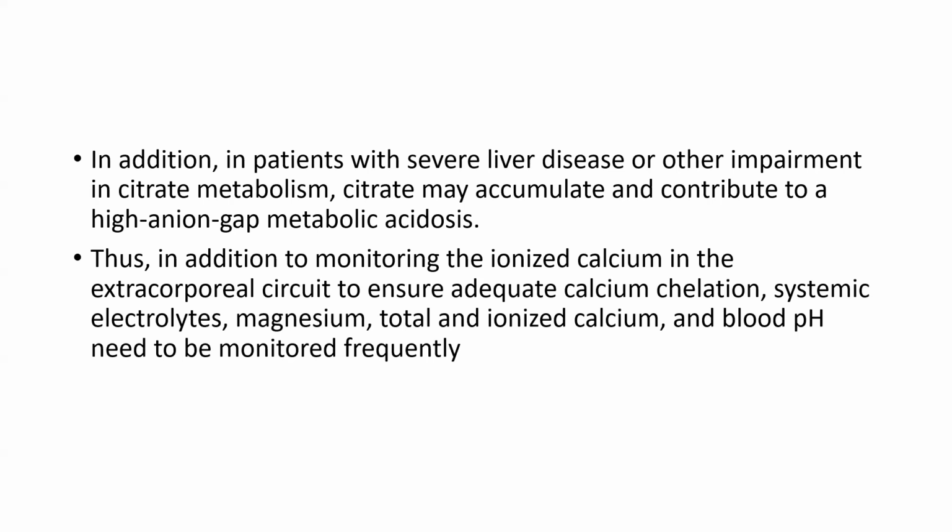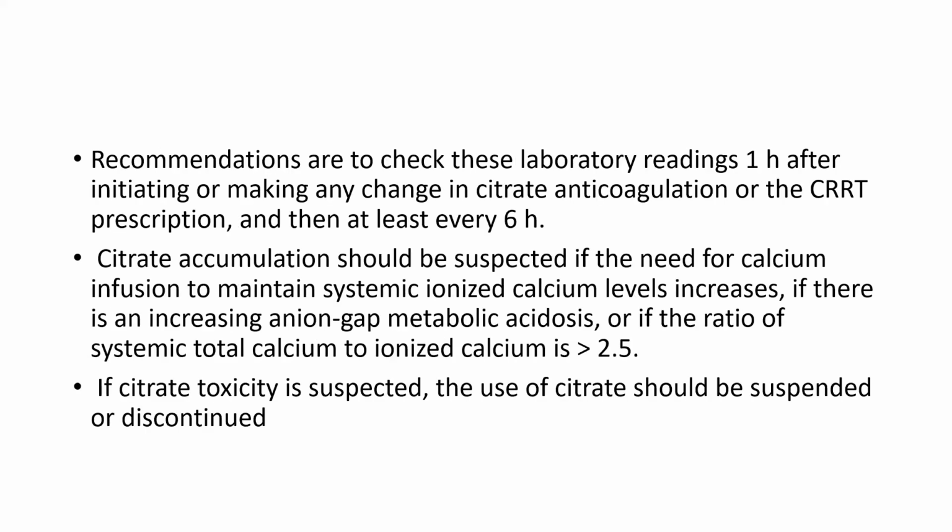Thus, in addition to monitoring the ionized calcium in the extracorporeal circuit to ensure adequate calcium chelation, systemic electrolytes, magnesium, total and ionized calcium, and blood pH need to be monitored frequently. Recommendations are to check these labs 1 hour after initiation or making any change in the citrate anticoagulation or CRRT prescription, then at least every 6 hours.